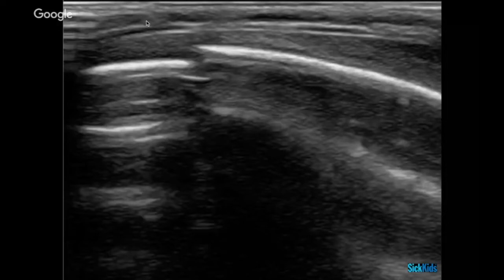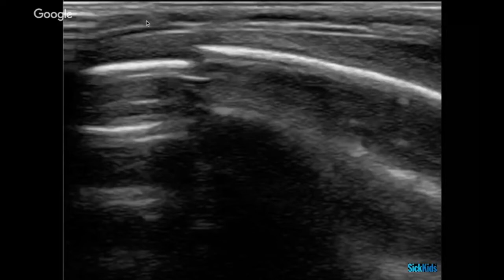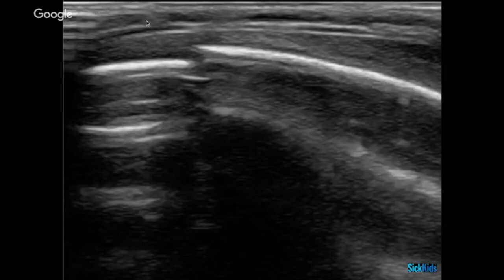In terms of hyperechoic things, this pathology here — yes, it's definitely a fracture. What kind of bone do you think it is? It's a curved structure, and we just don't image that many other curved smooth bones other than the skull. So that's a minimally displaced skull fracture. Now that we've talked about these different terms and artifacts, I'll turn this image over to you to describe it in ultrasound physics terms.